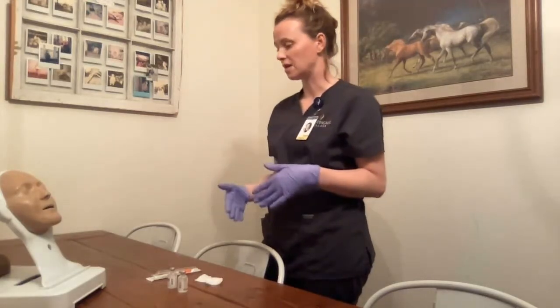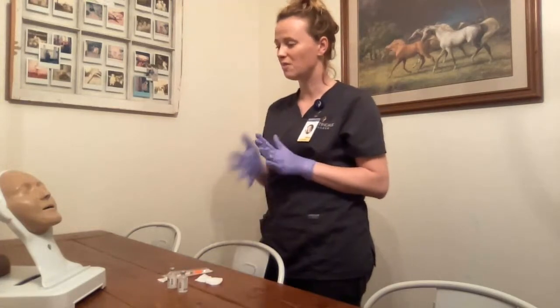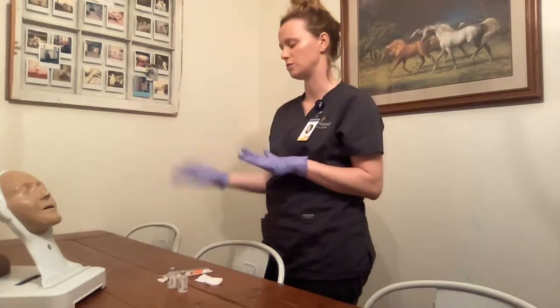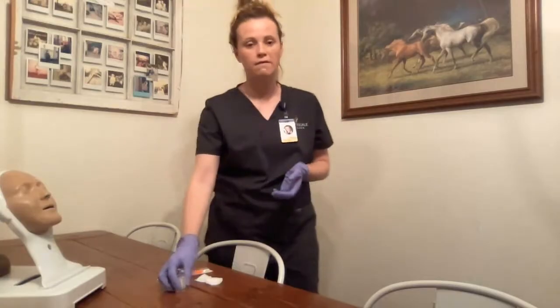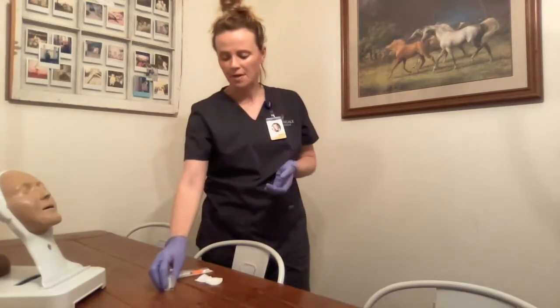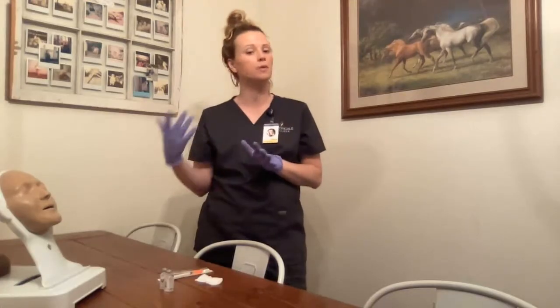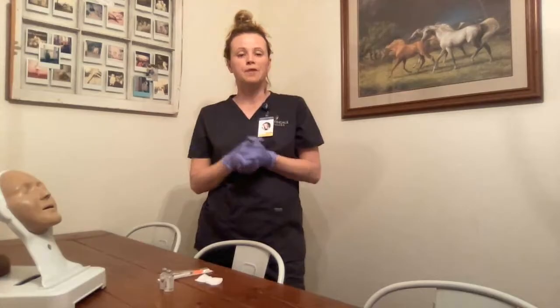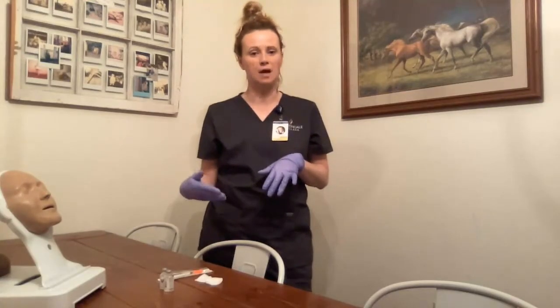For this injection, I will obviously come back and check on you. Upon injection, you may feel a slight stinging or burning sensation — that is normal. Do you have any questions for me? No questions? I verify the medication for a third time. At this point I would also get the patient's glucose levels and determine what their next meal is. I verify the medication three times now, but there are many other times I'll have to do that.